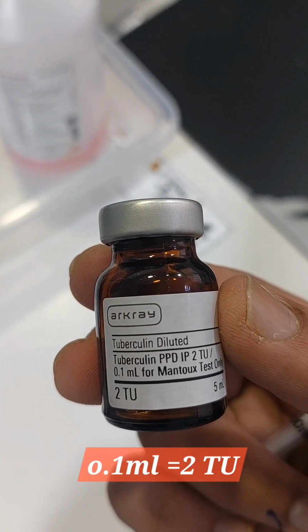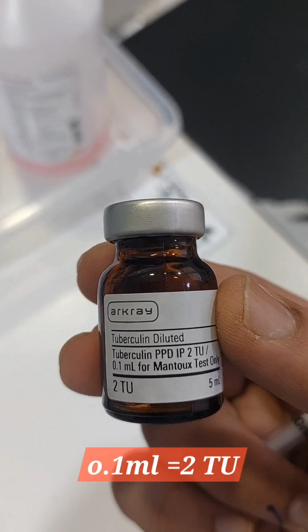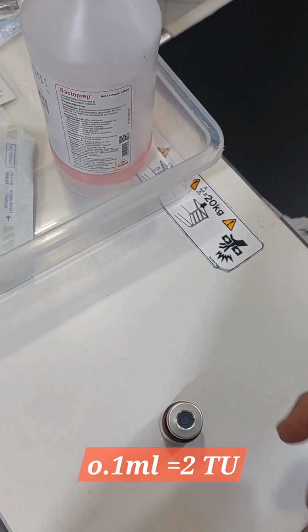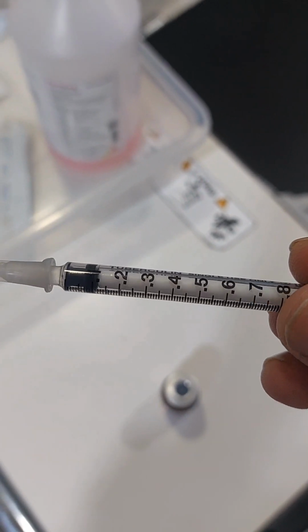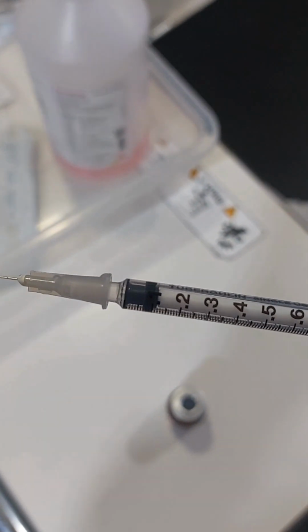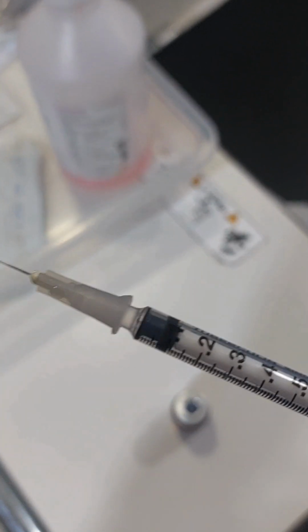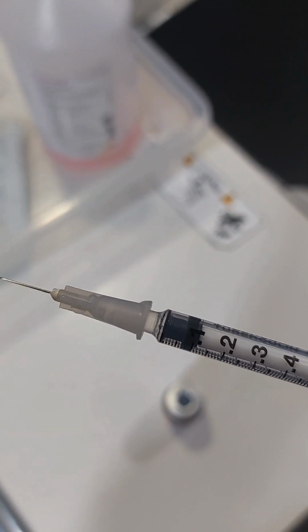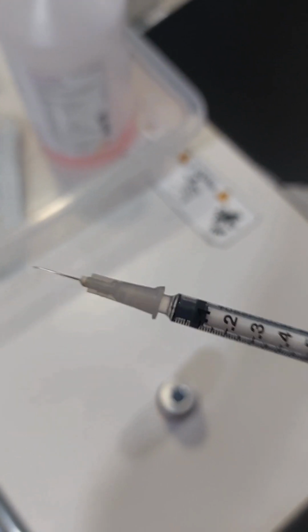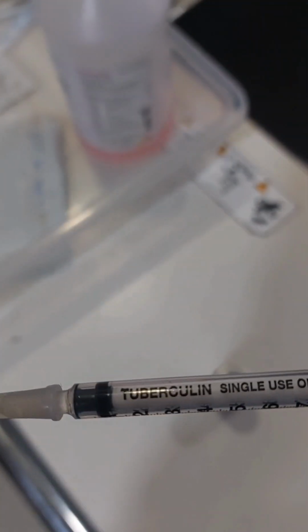See, this is the tuberculin PPD, 2 tuberculin units per 0.1 ml for the Mantoux test, and you can see this is the tuberculin syringe, and here are the markings from 0.1 ml, 0.2 ml. As you know, 0.1 ml contains 2 tuberculin units, so we have taken 0.1. And if you have to give 1 tuberculin unit, then we have to give 0.05 ml, that means half of 0.1 ml. So this is the tuberculin syringe, you can see.